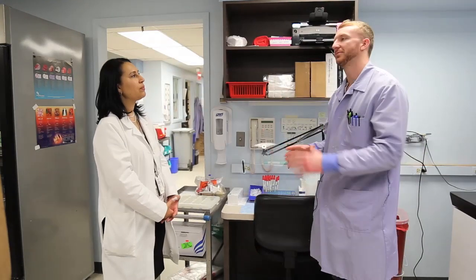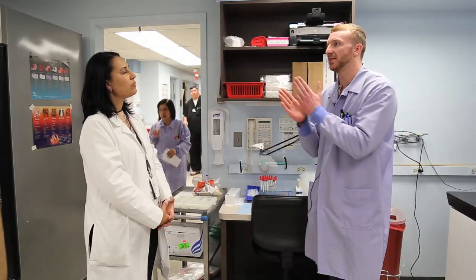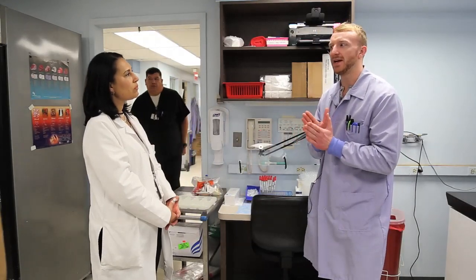Over there with BioFire, you had the syndromic panels with 27 to 30 different targets, bacterial and viral, fungal as well. This is more your specific 1 to 2 targets. MRSA versus methicillin-susceptible Staph aureus, things of that nature that just have one PCR target and just need the primers for that particular organism.